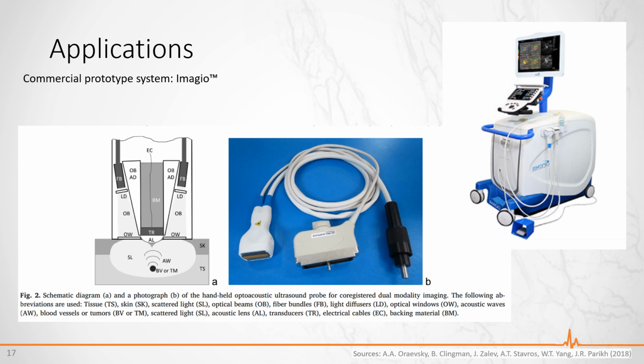In a very simplified version now, but this is enough to understand this device, at least on the surface. Because of this effect, the amount of blood vessels around a possibly malignant structure can give clues whether the structure is pathological or not. And this is what PAI can be used for very efficiently.